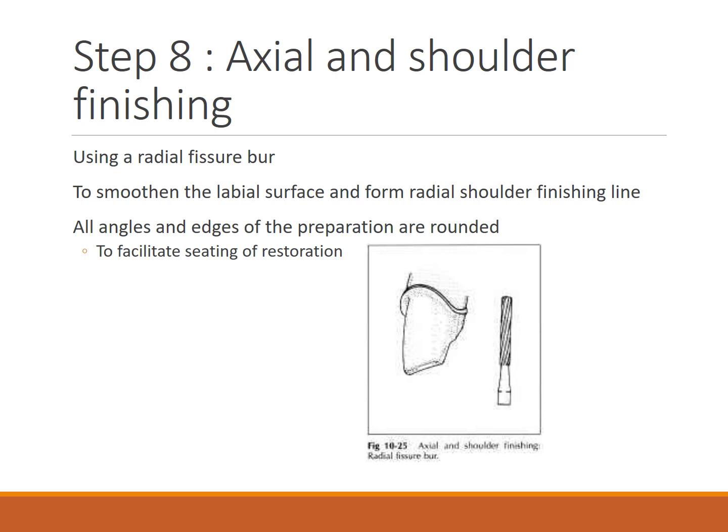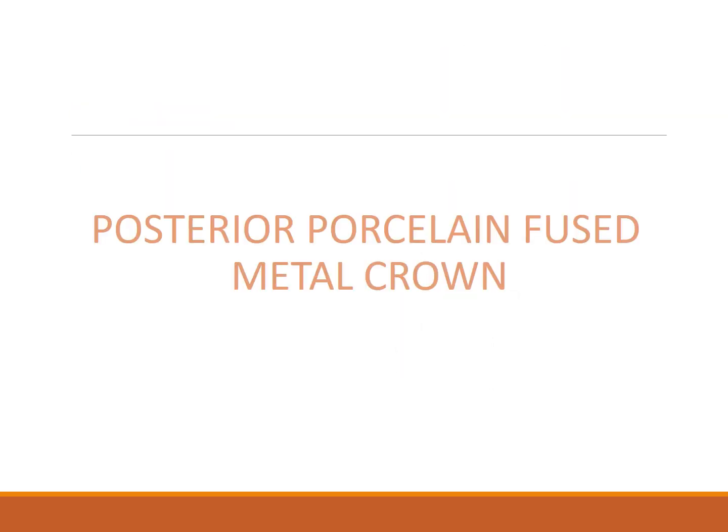Always remember, everything has to be parallel usually, and it should be equal everywhere. The reduction should be not too thin, not too thick, and it should be perfect everywhere. Everywhere has to be smooth. There should be no sharp line or point angles.